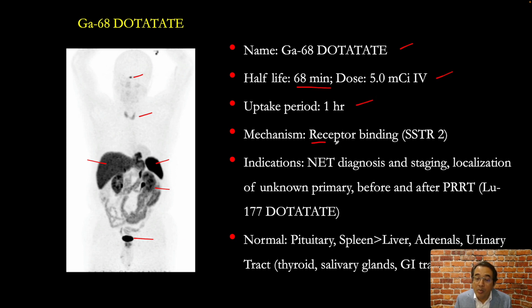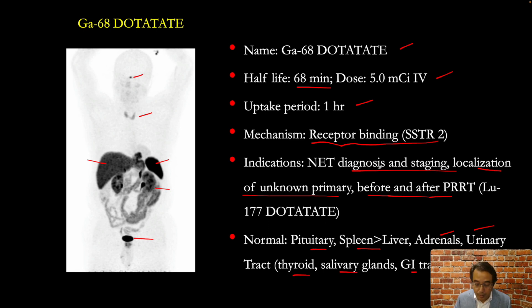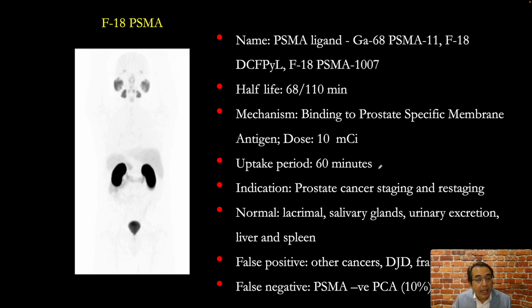The mechanism of uptake is receptor binding to somatostatin receptor subtype 2. The applications for this study include neuroendocrine tumor diagnosis and staging, localization of unknown primary, and before and after peptide receptor radionuclide therapy using high-dose lutetium-177 dotatate. Normal uptake is seen in the pituitary, spleen (more intense than the liver), adrenals, urinary tract excretion, and faint activity in the thyroid, salivary glands, and GI tract.